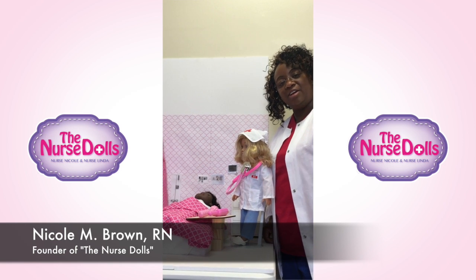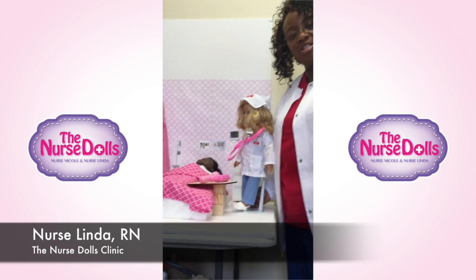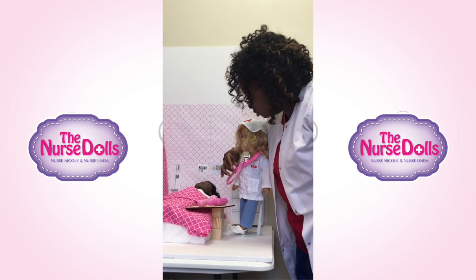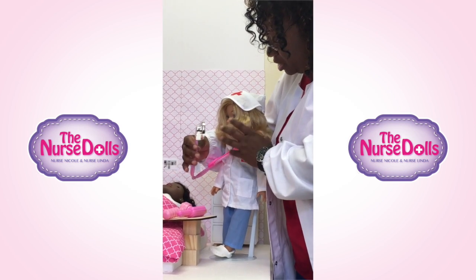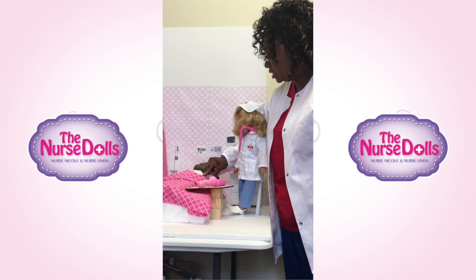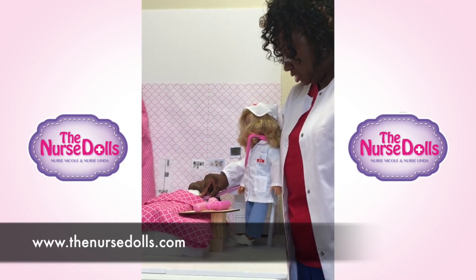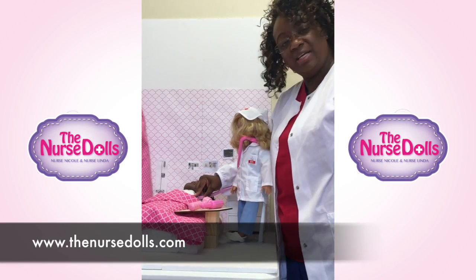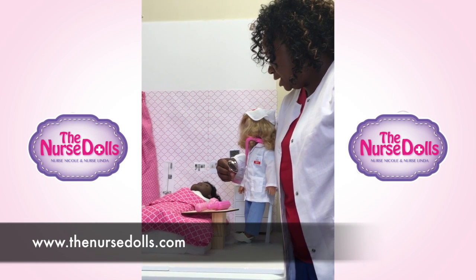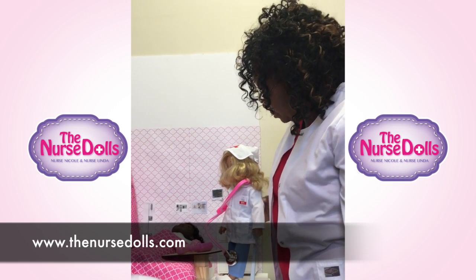Hello, this is Nurse Nicole again — Dr. Nicole M. Brown. We are over at the Nurse Dolls clinic. Nurse Linda is here with her first patient doing an assessment, which includes listening to a heartbeat. She has her stethoscope on with the earpieces in her ears, the tubing, and the diaphragm at the bottom. She's going to listen to the left side of the patient's chest for one minute and look at her watch. It's been a minute — Miss Jones, your heartbeat is 84. That's good, that's within the 60 to 100 range. Thank you, Nurse Linda.